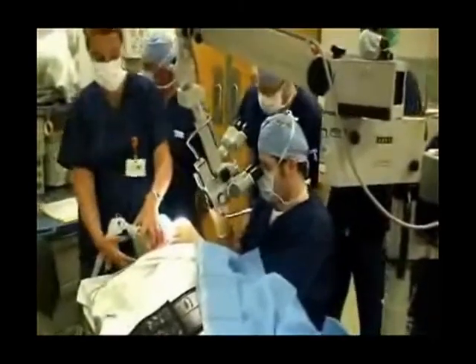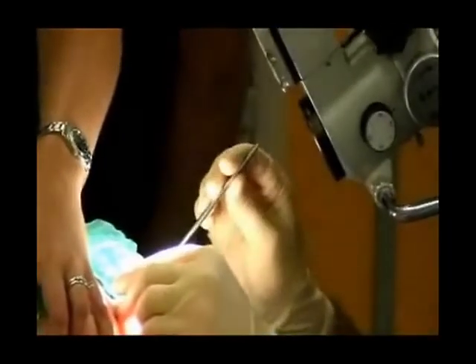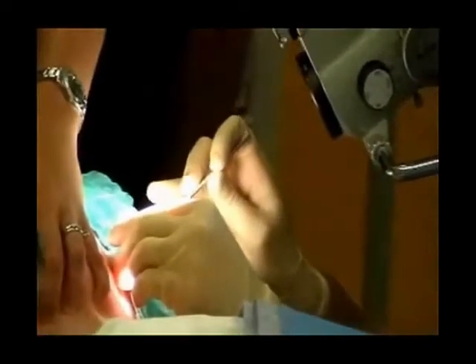Acute infections are treated with antibiotics. If fluid persists, ventilation tubes may be inserted. Ventilation tube insertion is probably the most common procedure performed in the United States today, perhaps other than circumcision. The operation is fairly straightforward. We make an incision in the eardrum, we remove the fluid from the middle ear space, and we insert a grommet, a little tube that is situated in the tympanic membrane. Part of it is in the ear canal, part of it is in the middle ear, and the purpose of the tube is to aerate or ventilate the middle ear space to prevent fluid from reaccumulating.